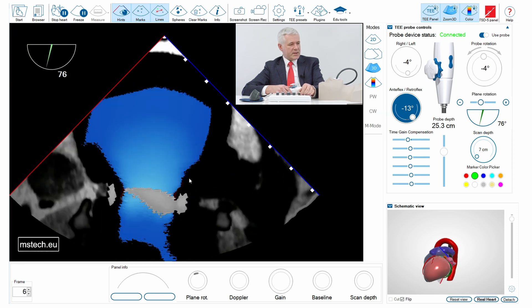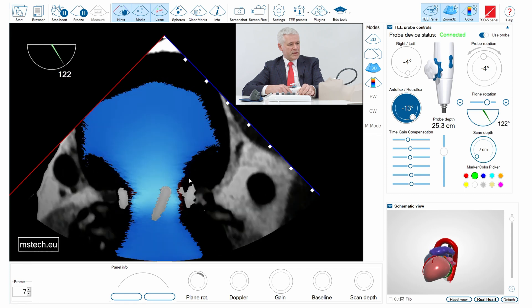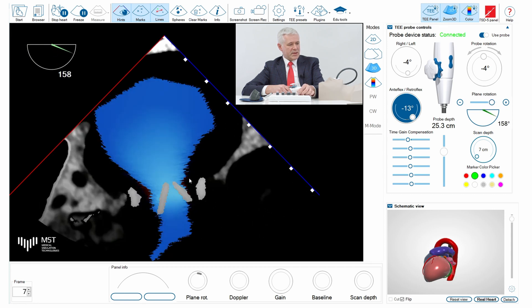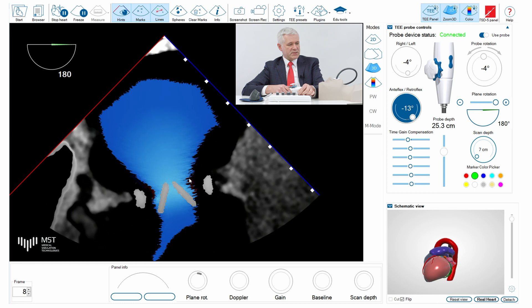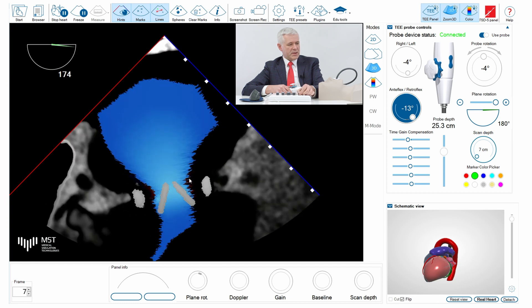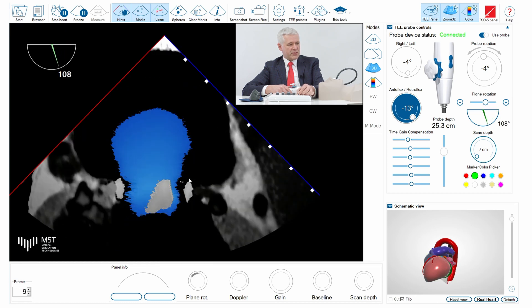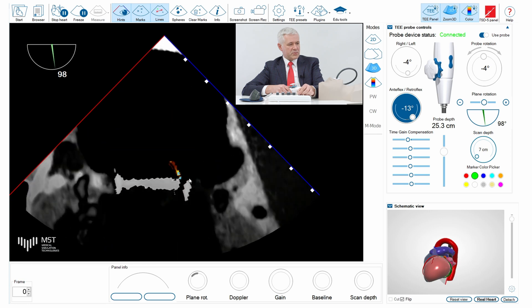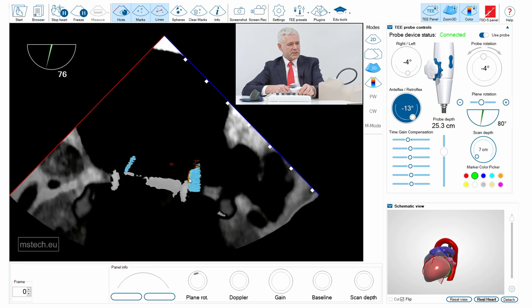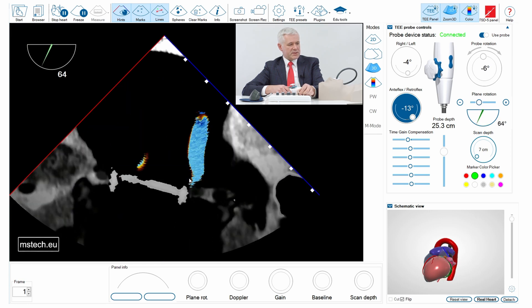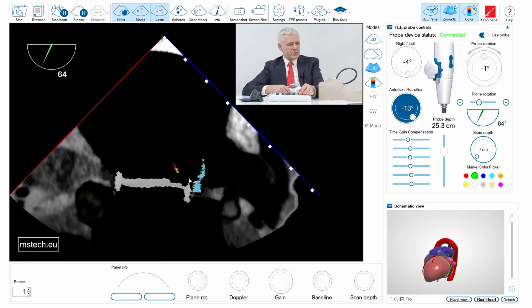Then when I turn more, you can see again little jets which are completely normal. I come back to see where this paravalvular leak was located, and I can see it's located in the 64 degrees view.